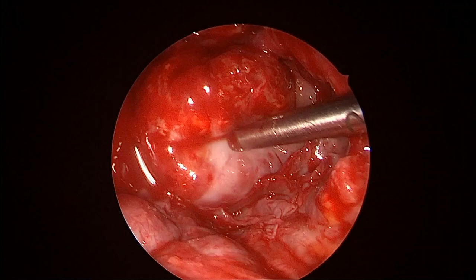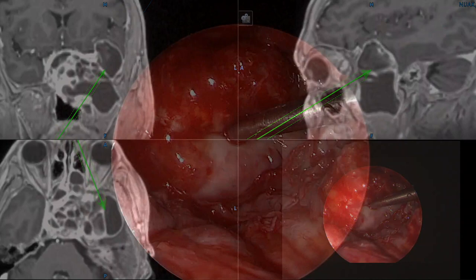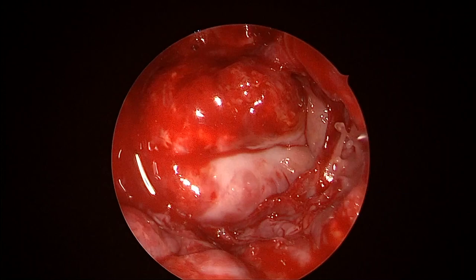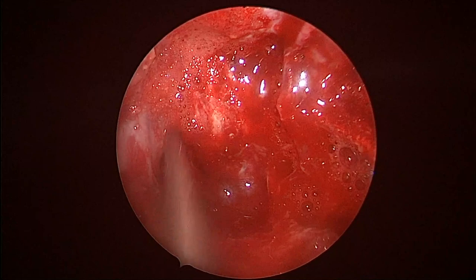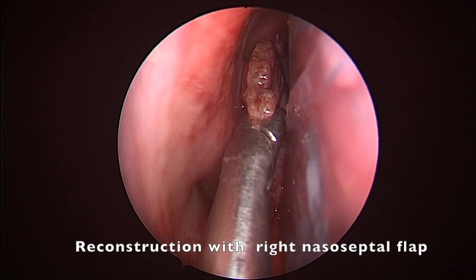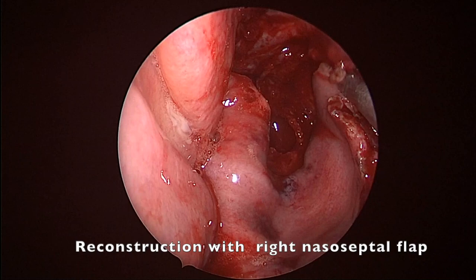At the middle cranial fossa, we confirmed the brain had herniated back into its regular position. Navigation was essential to confirm complete resection of the tumor. All components were resected including the sphenoid, clival component, middle cranial fossa, and infratemporal fossa. The anterior maxillectomy was critical for passing instruments in parallel and utilizing two corridors into this large lesion.